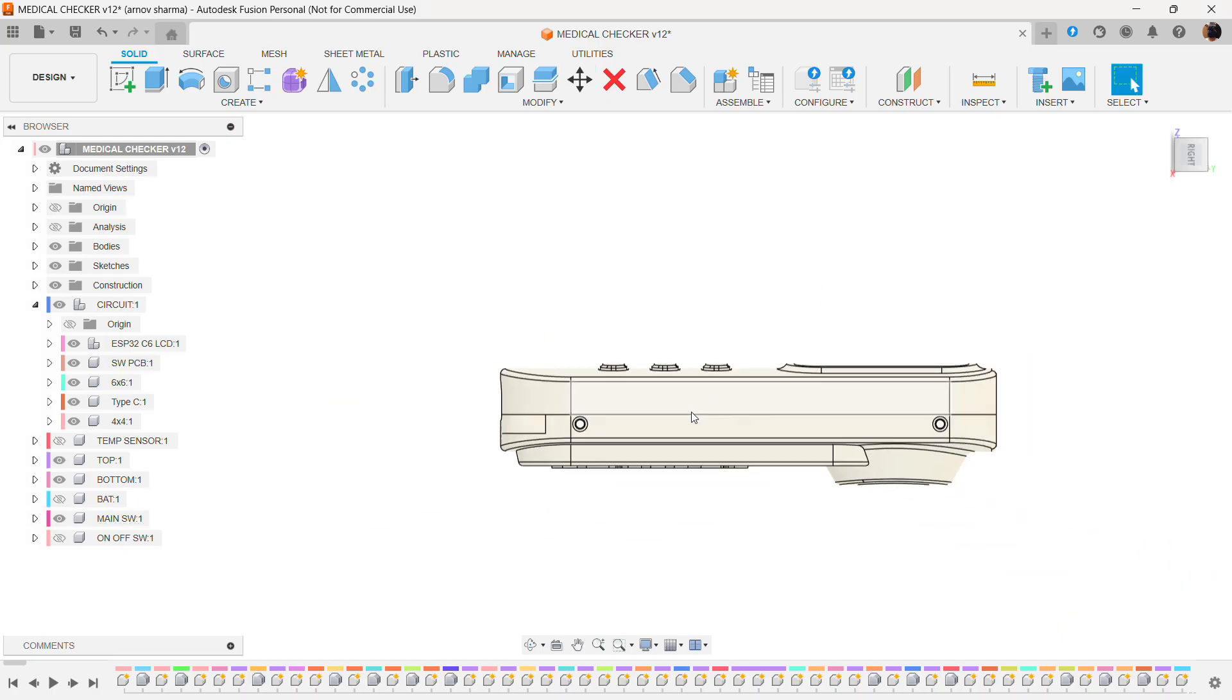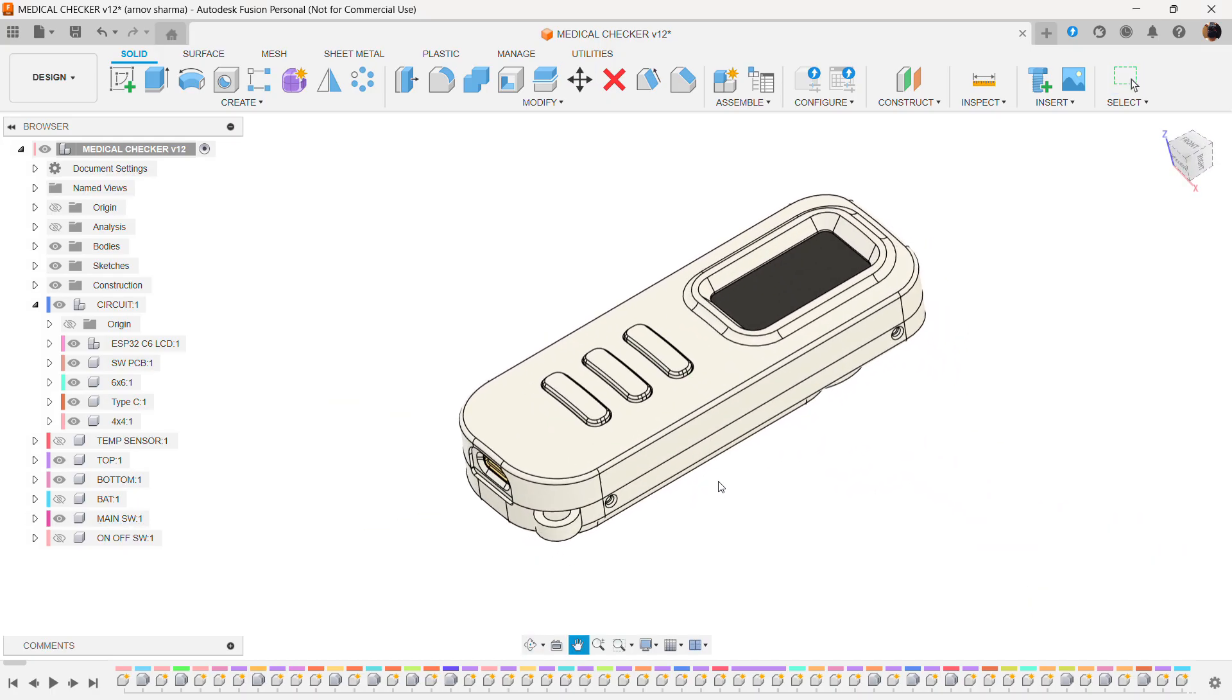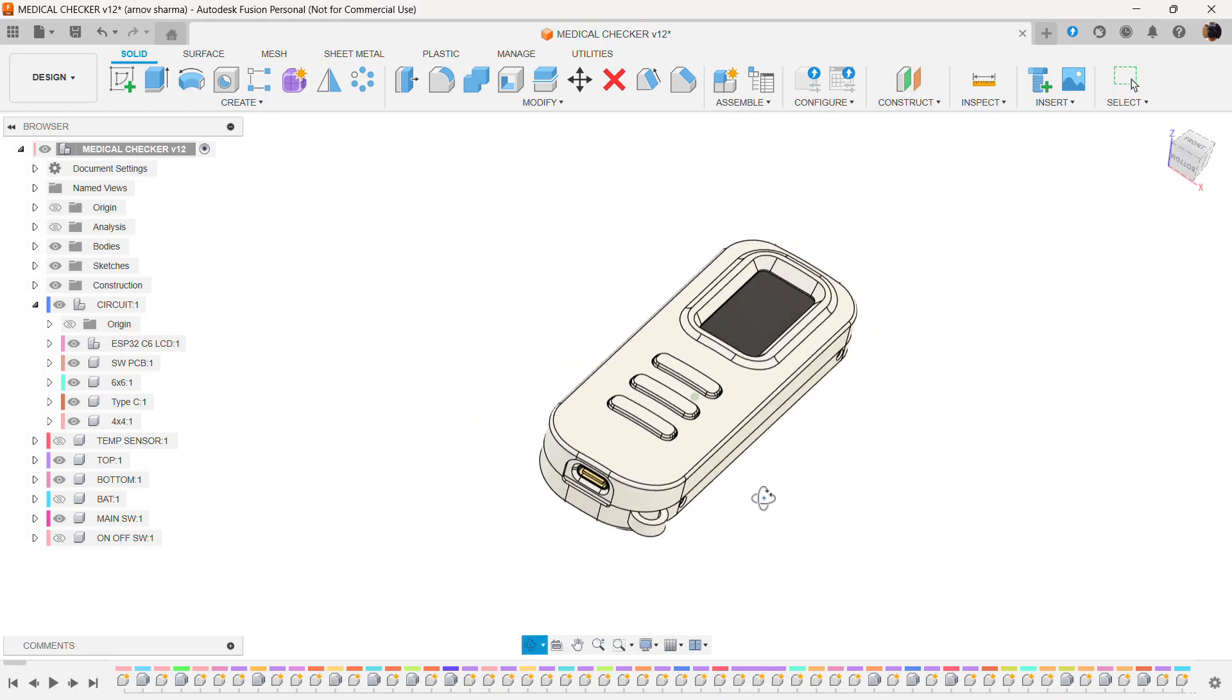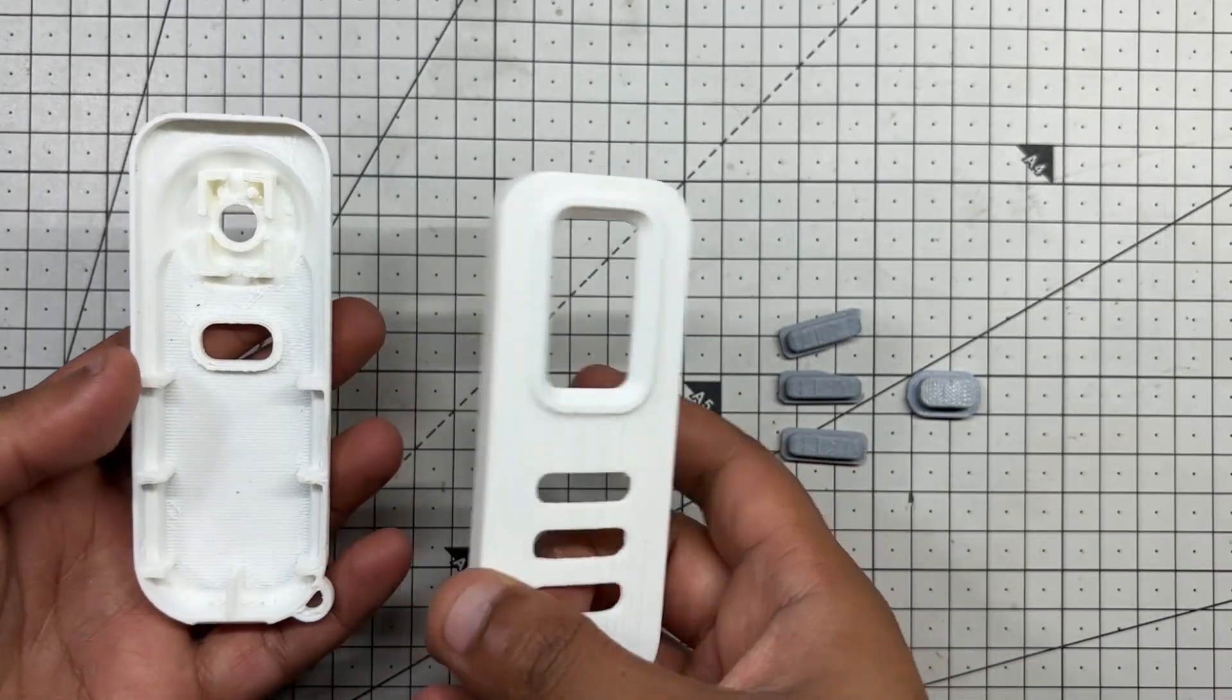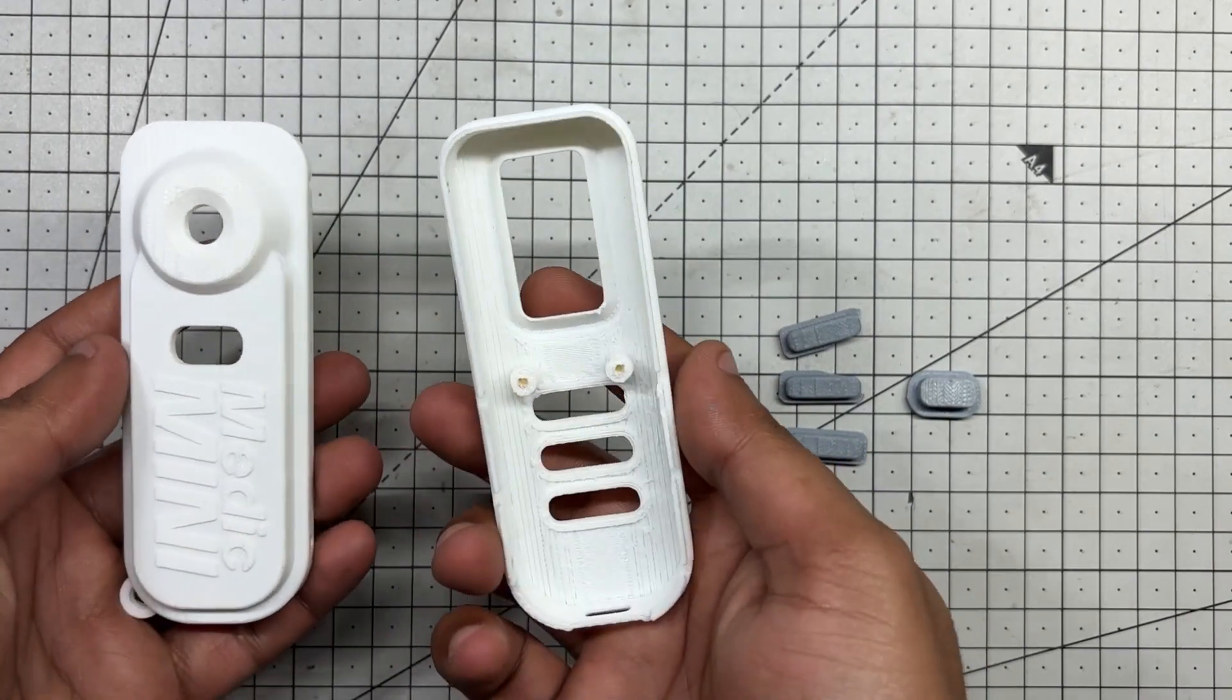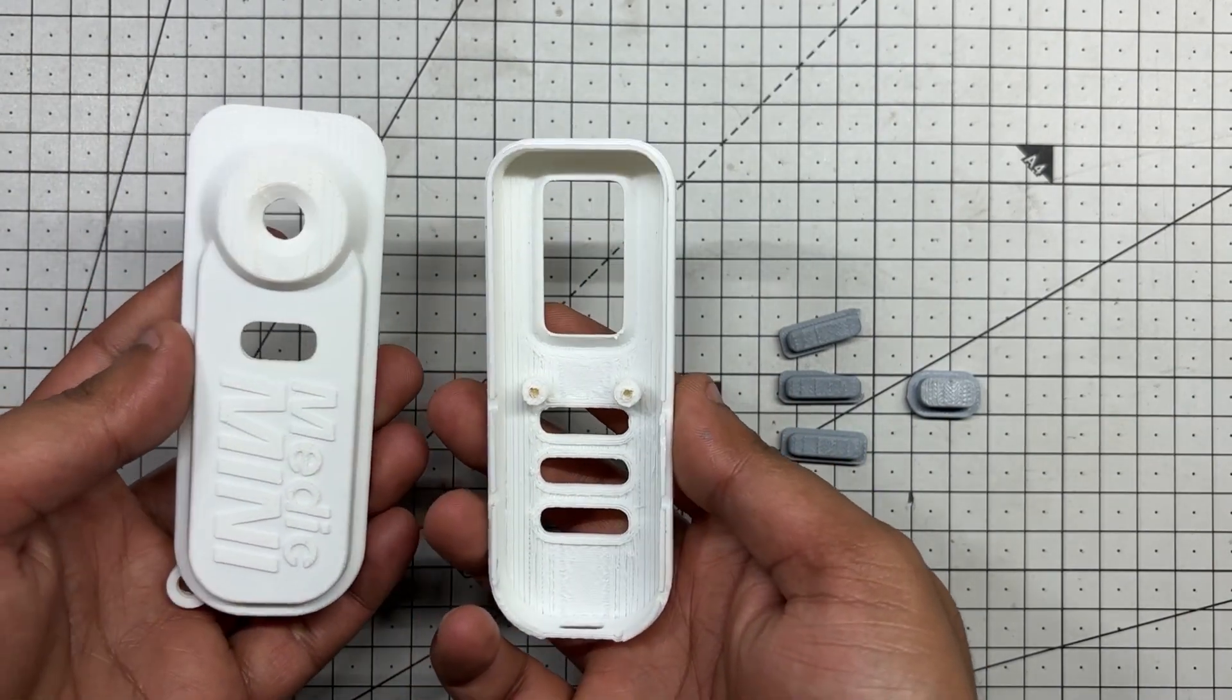The enclosure consists of two interlocking halves, secured together with screws. We printed both halves with white PLA, while the button actuators were all printed in grey PLA.